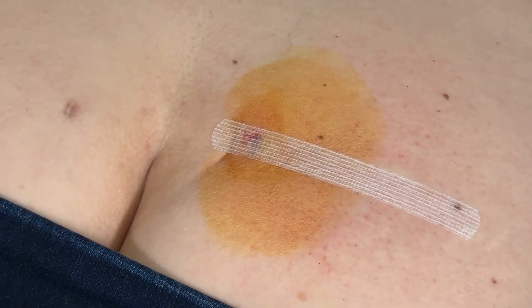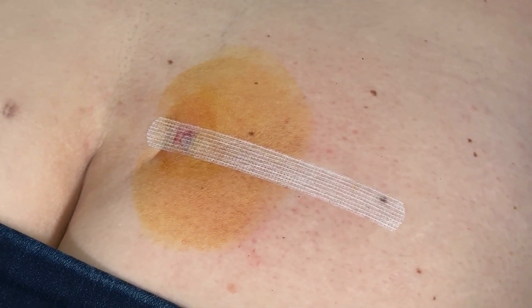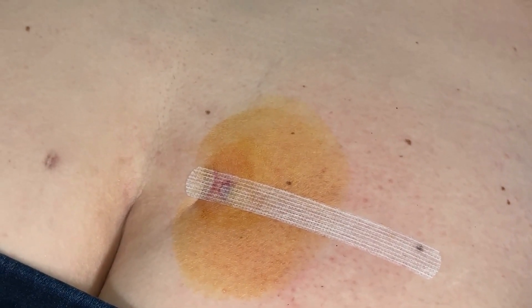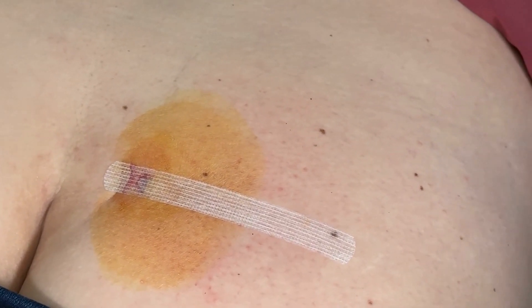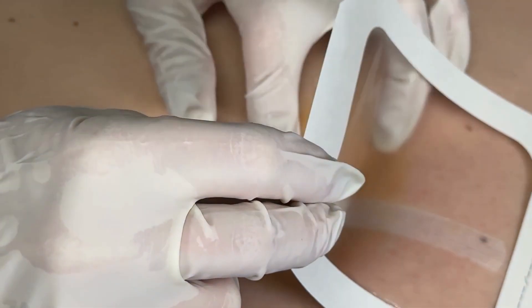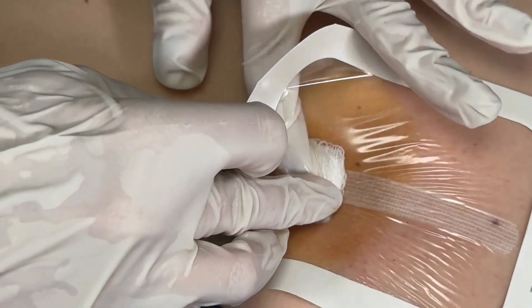Then on top of the steri-strip we put a little gauze dressing and a tegaderm — a clear dressing. Remember to keep that on for at least five days as well, unless it gets wet underneath or if the bandage gets saturated with blood.